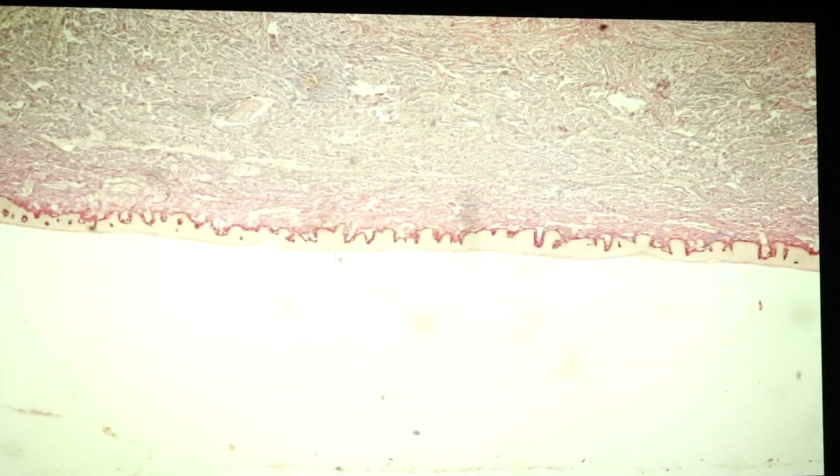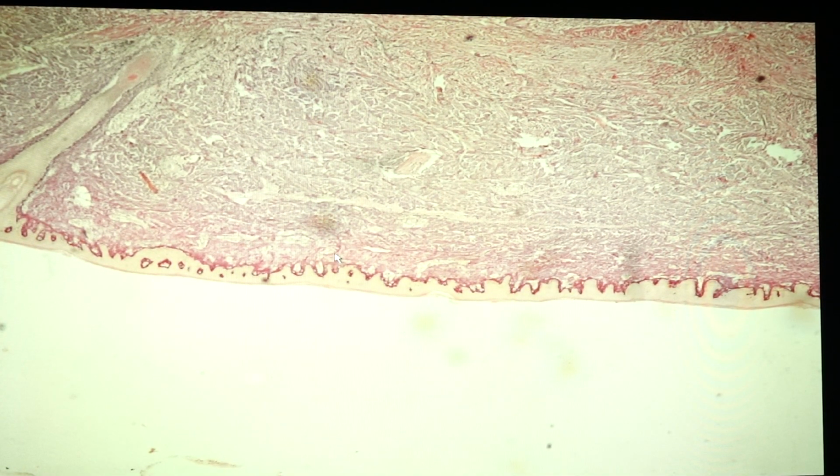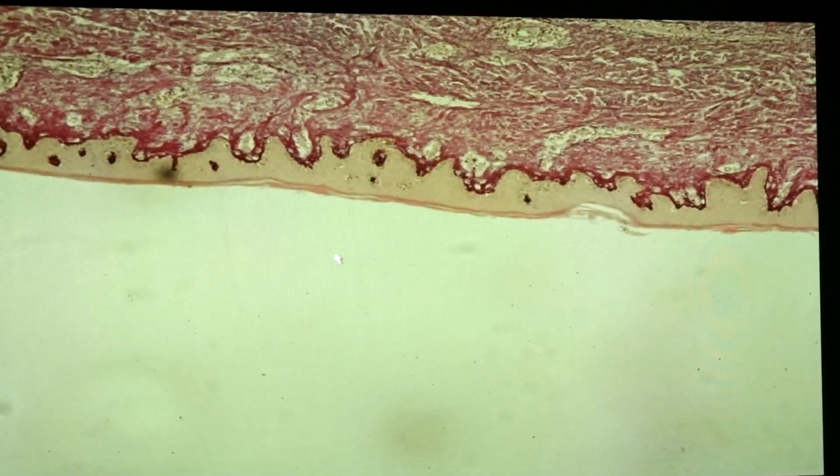Slide 22, this is fibrosarcoma. Fibrosarcoma is a malignant tumor that is derived from the fibroblasts. So again, when you are asked what is the origin of this particular tumor, you have to specify not just mesenchymal, but it should be stated as coming from the fibroblast or from fibrous tissue. So this has a not too good staining quality.